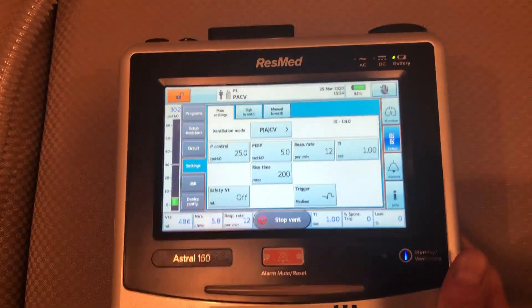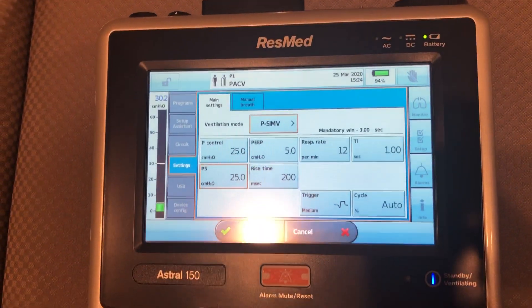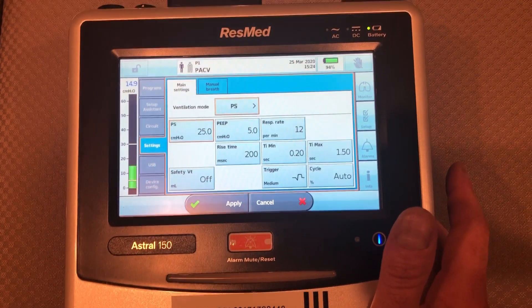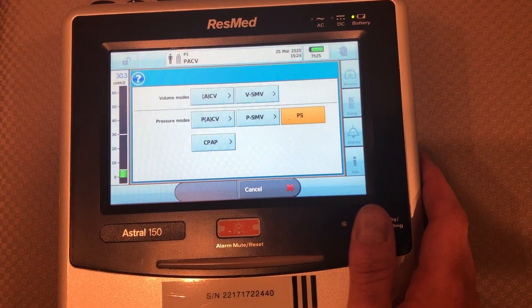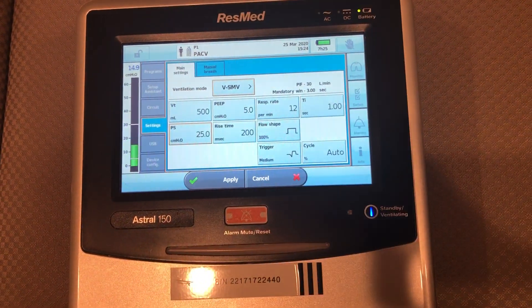There are other modes that you can use on this unit, as you saw. You have SIMV with pressure support, a true pressure support mode, and CPAP. Your volume modes are assist control as well as SIMV.